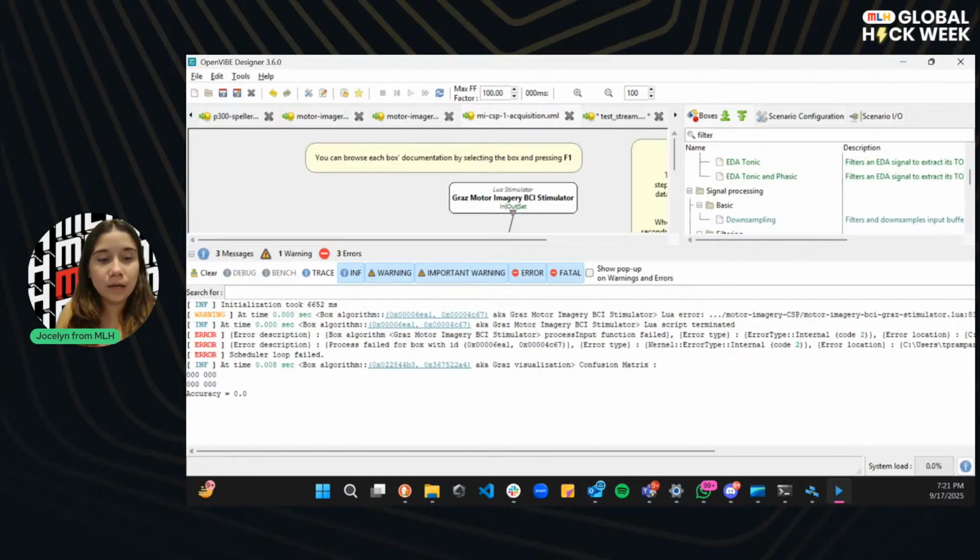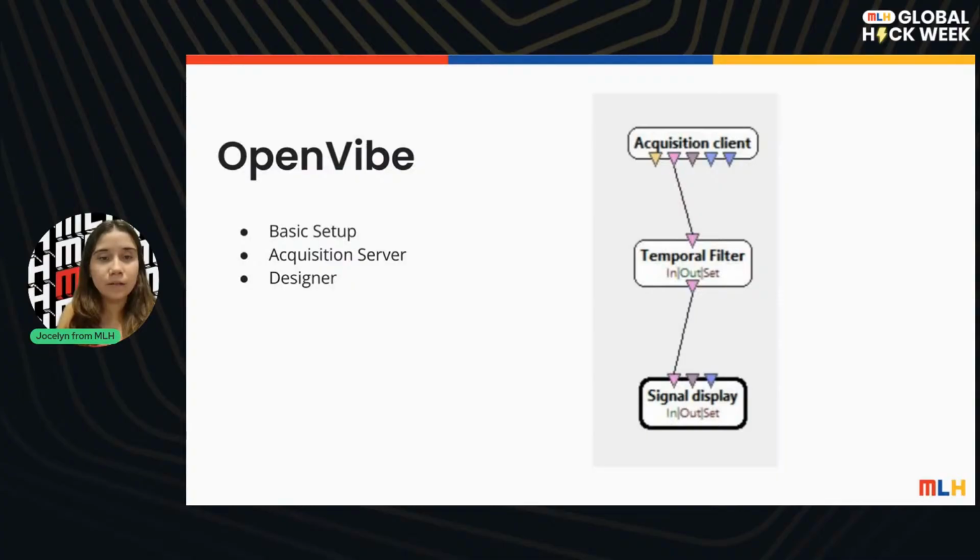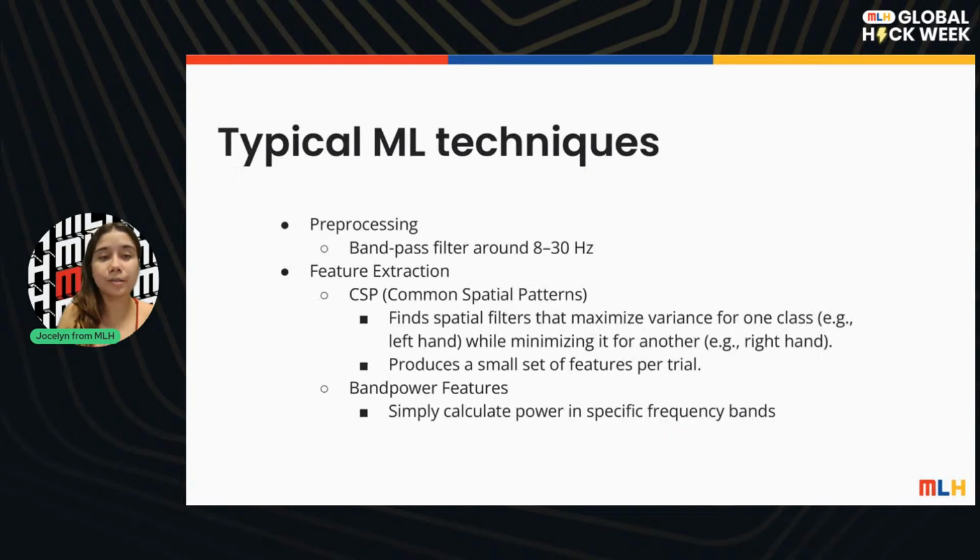Okay, so I'm going to stop sharing my screen for OpenViBE now, and I'm going to continue with our slides. We only have a couple more left before we go to the live demo, because I think that one will take me a while to set up. I have my headset over here, and I have to turn it on and then log into the software and everything, so I can show you how it actually works.